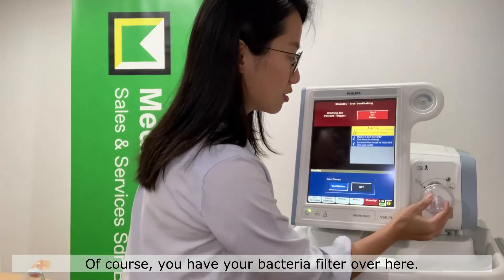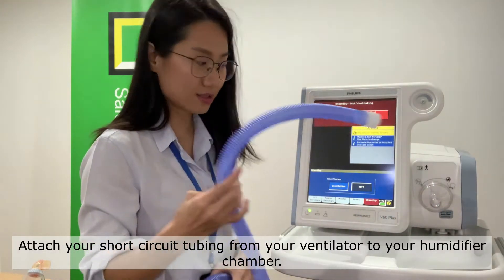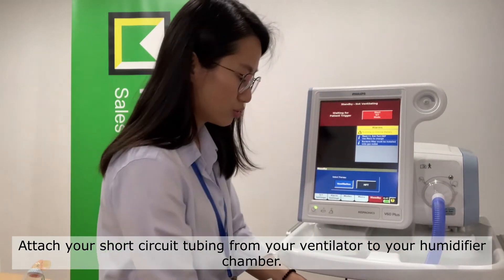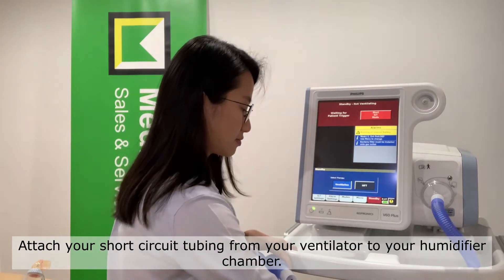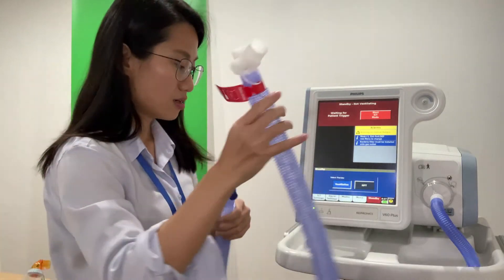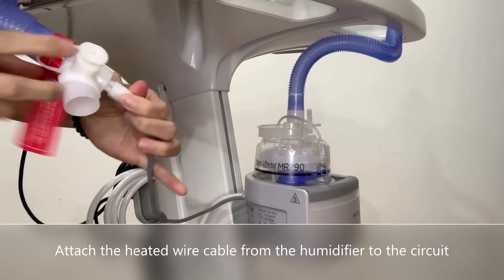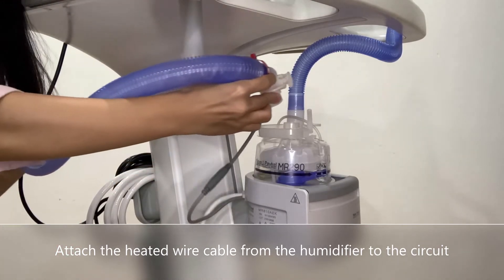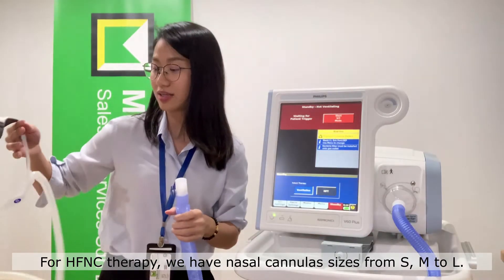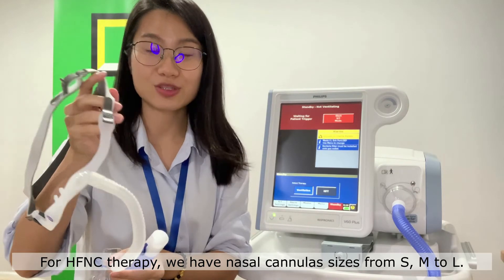You have to have your bacteria filter over here, then your short circuit tubing from your ventilator to your humidifier chamber, and then the long inspiratory circuit. For high flow nasal cannula therapy, we have nasal cannulas available from sizes S, M, and L.